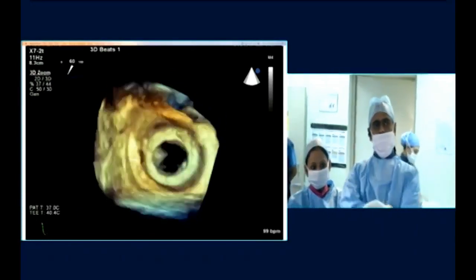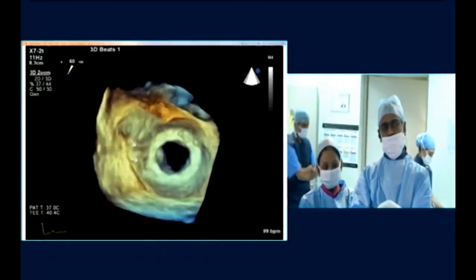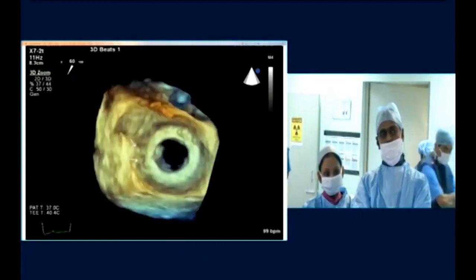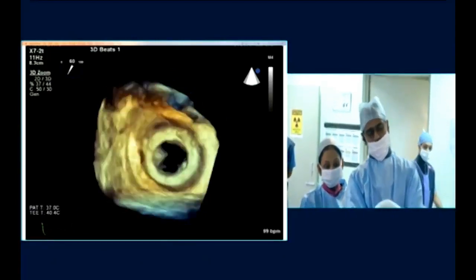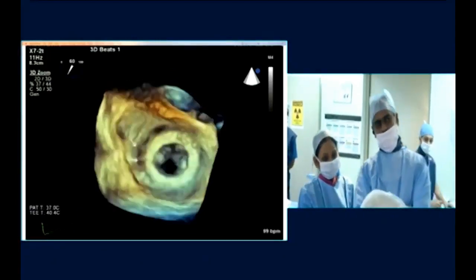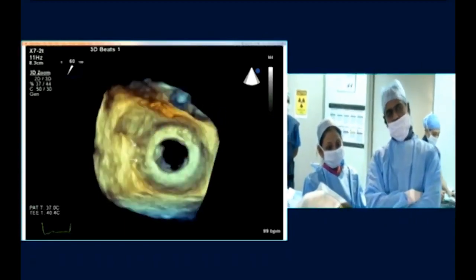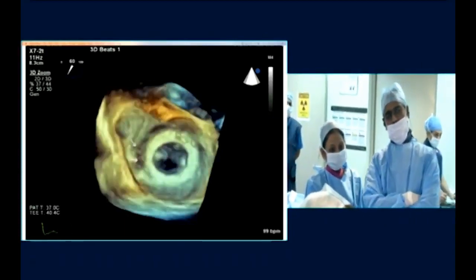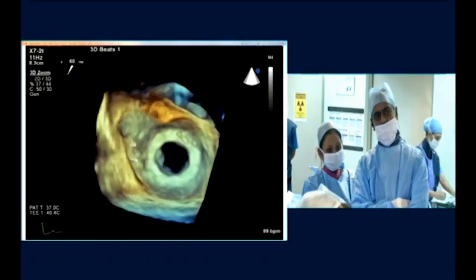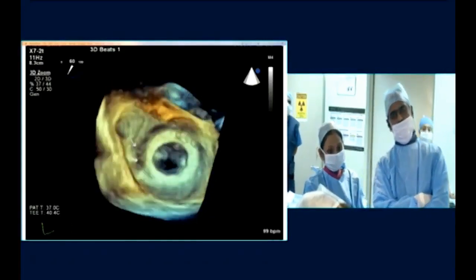This is the 3D transoesophageal echocardiography. What you are seeing in the center is the mitral prosthesis. On the left-hand side at 10 o'clock is the left atrial appendage. Anteriorly at around 1 o'clock is the aortic valve, and what is shown with the marker is the paravalvular leak.